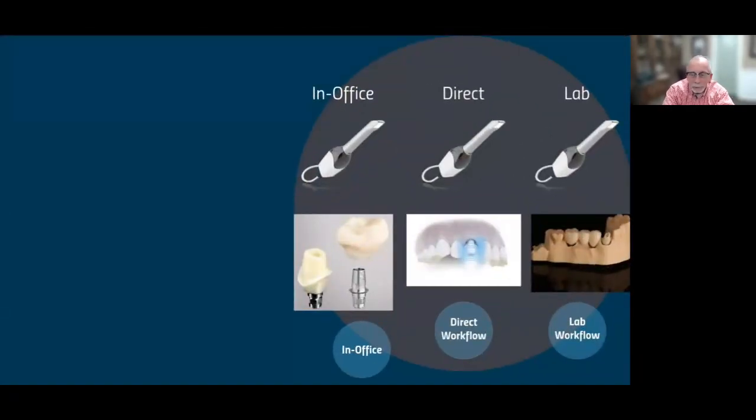If you have a scanner, there are options out there that say, hey, I'm going to put something in the mouth. I'm going to scan it. I'm going to go over to my software and create something. Then I'm going to go over to a mill or a printer. I'm going to get an output of that restoration. And I'm going to go back to the patient and put it all in. You can do it totally in office. That is done. And there are certainly systems out there you can get to do that, but it's not the most popular.